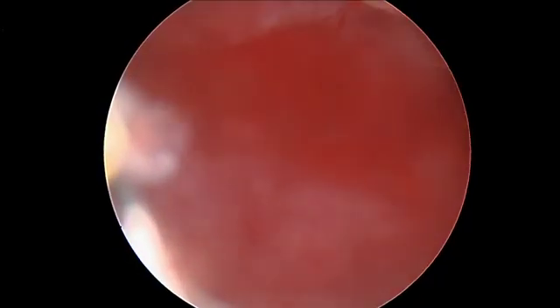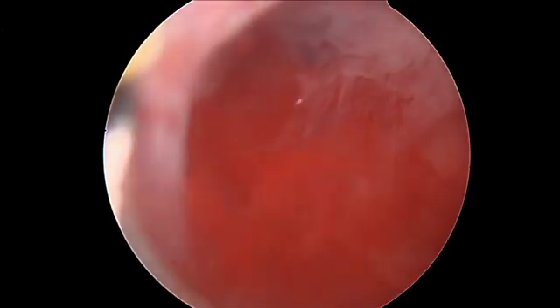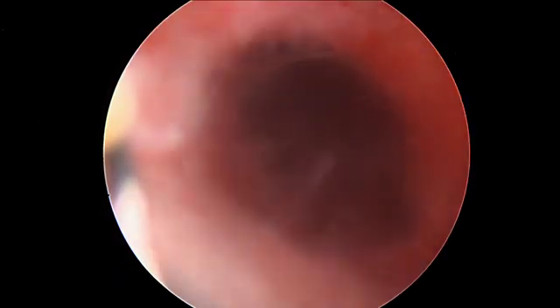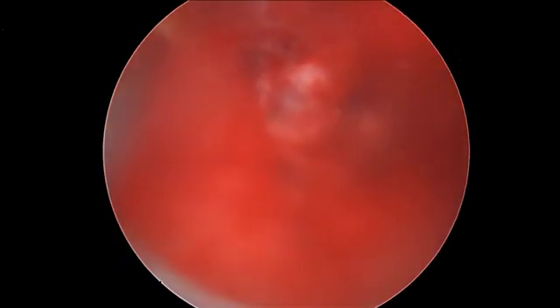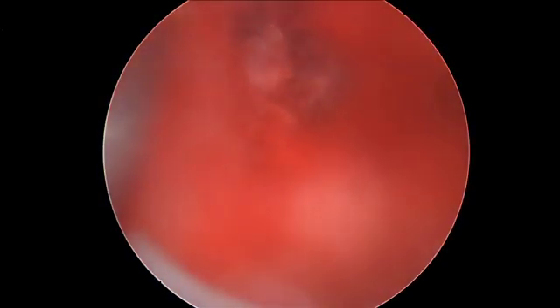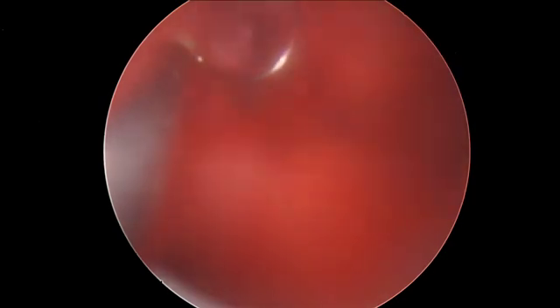Once adequate tissue was obtained, we proceeded with hysteroscopy using the 10mm resectoscope and glycine, and noted a normal endometrial cavity. One can note the large c-section niche which previously contained the gestational sac. Residual pieces of gestational tissue were resected without energy. We did not feel the need to proceed with laparoscopy, as the products of conception were felt to have been adequately resected and bleeding was controlled.